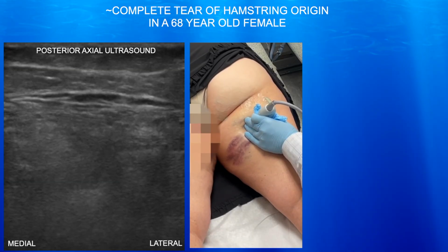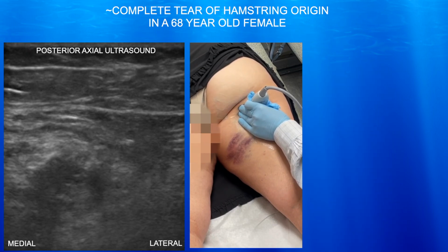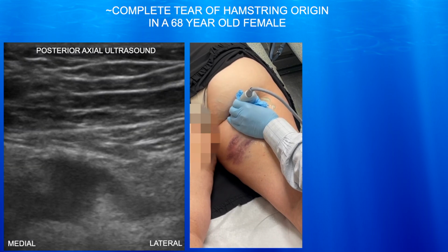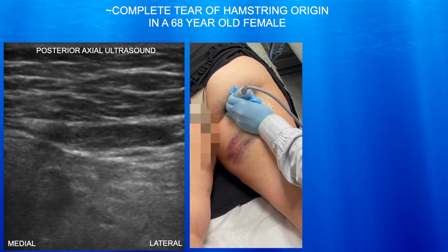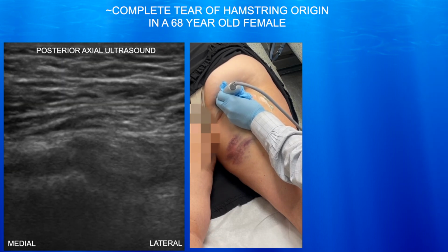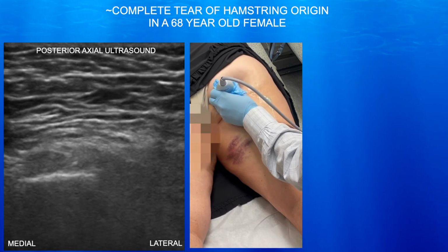And now we're going up proximally again towards the ischial tuberosity. You can see the extent of this hematoma as it covers quite a fair amount of territory. And here we're going proximally again towards the ischial tuberosity. There may be some tendon fibers attaching to the ischial tuberosity, but it's unlikely that these fibers are continuous with the muscle distally.